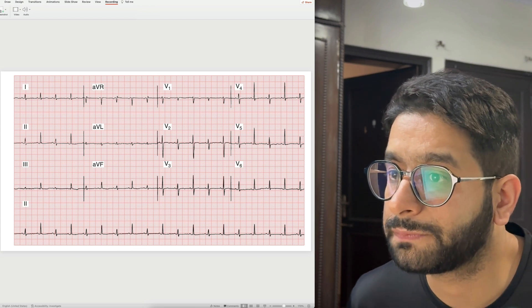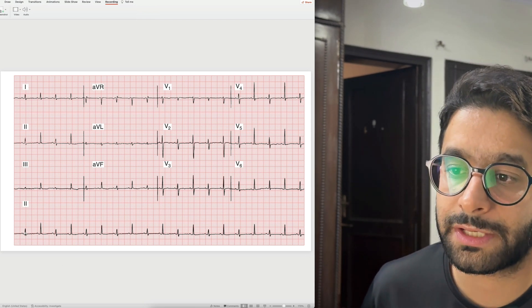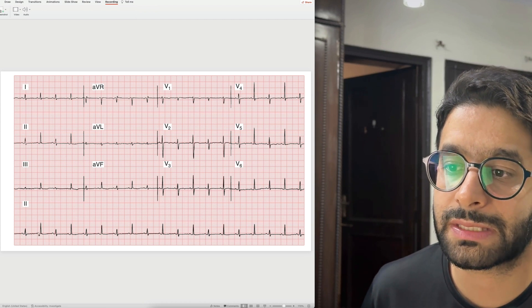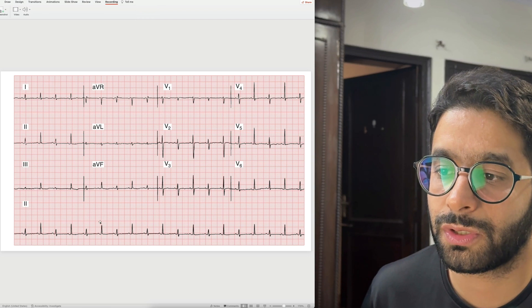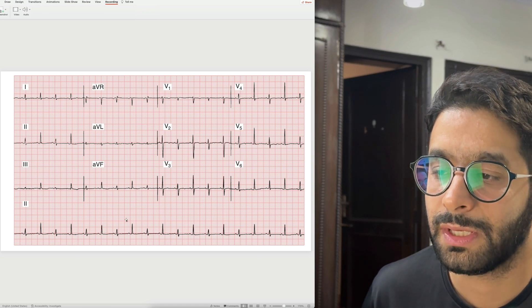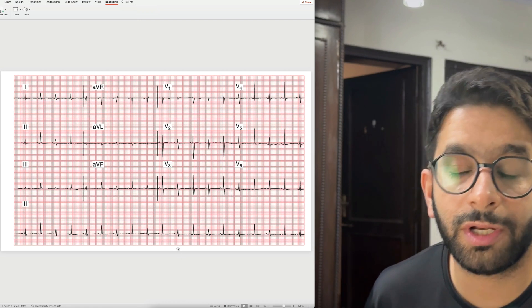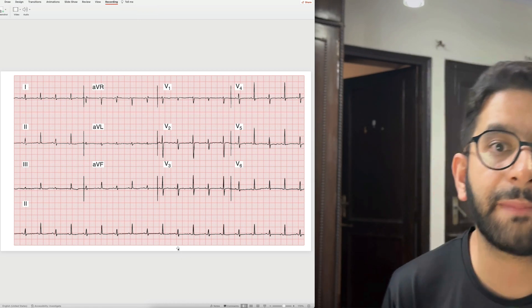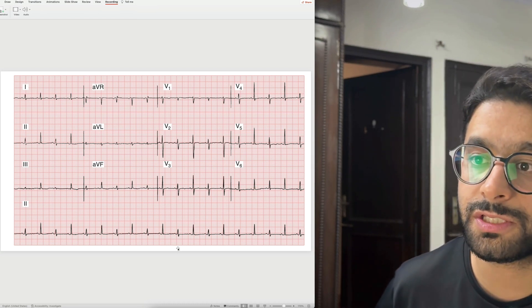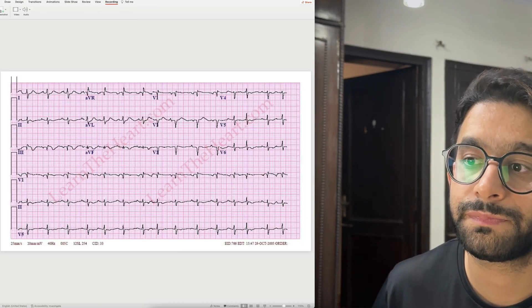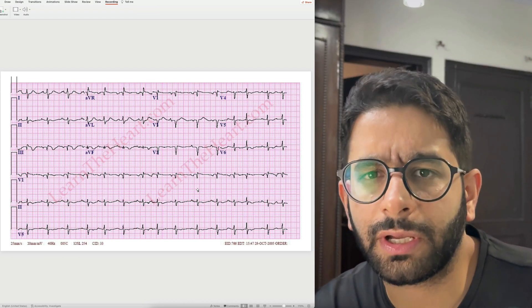In this ECG, what you see is known as QRS alternans or electrical alternans: one QRS complex is tall, the other is short — tall, short, tall, short; high amplitude, low amplitude. This is QRS alternans, and it is important because it signals pericardial tamponade. So QRS alternans or electrical alternans suggests pericardial tamponade.